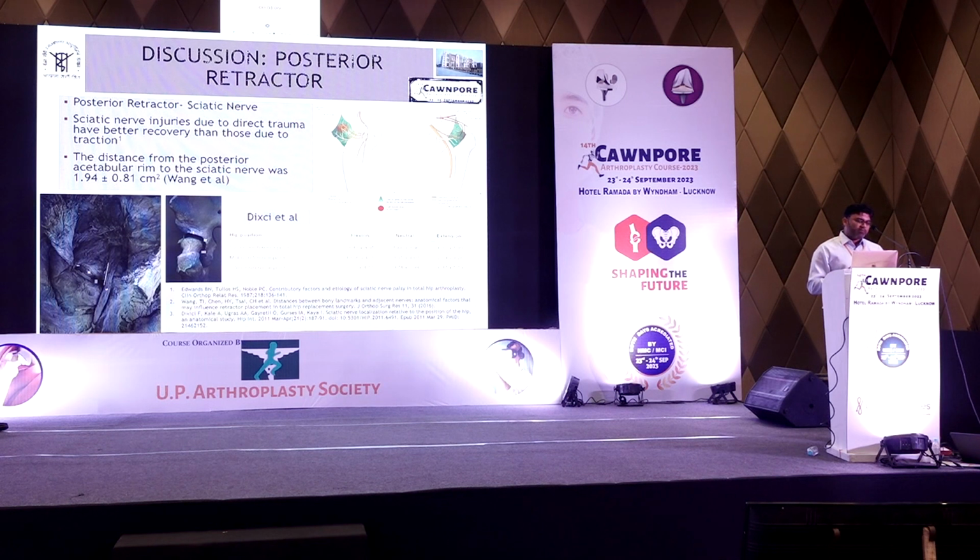Now coming to the posterior aspect. Sciatic nerve, as we all know, especially in dysplastic hips, tight hips, the sciatic nerve is very close to the edge of the acetabulum. So you have to be careful in those cases. But still, in those cases, if you take the hip in extension, the sciatic nerve falls under a bit less tension, and then you can put your posterior retractor. Often, the sciatic nerve is around an inch away from the edge, so you have quite a safe distance over there.